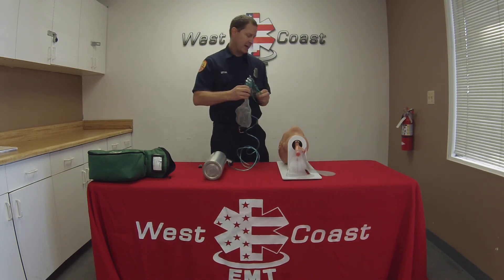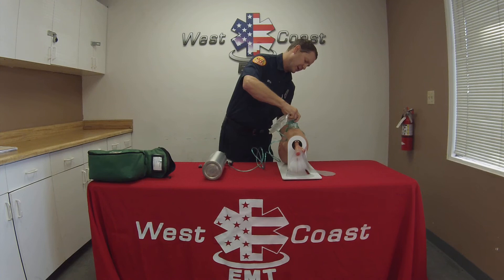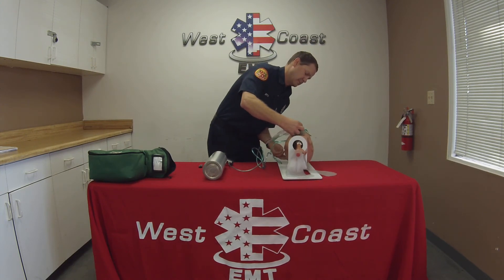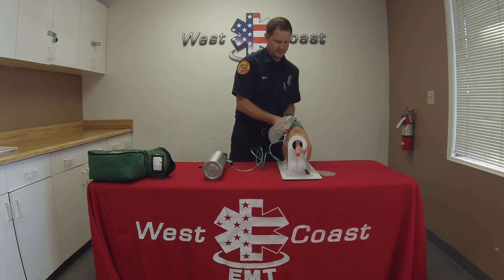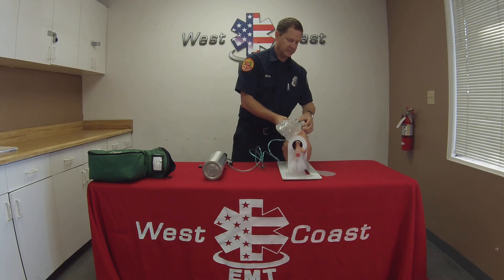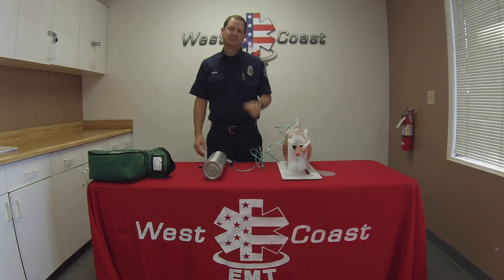I will go ahead and place this over my patient and then tighten it down using these two straps. I'm now done with this skill.